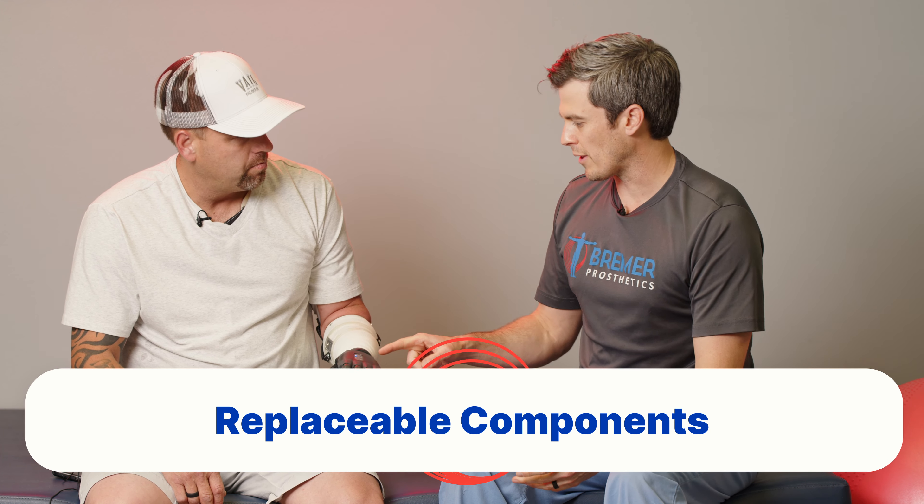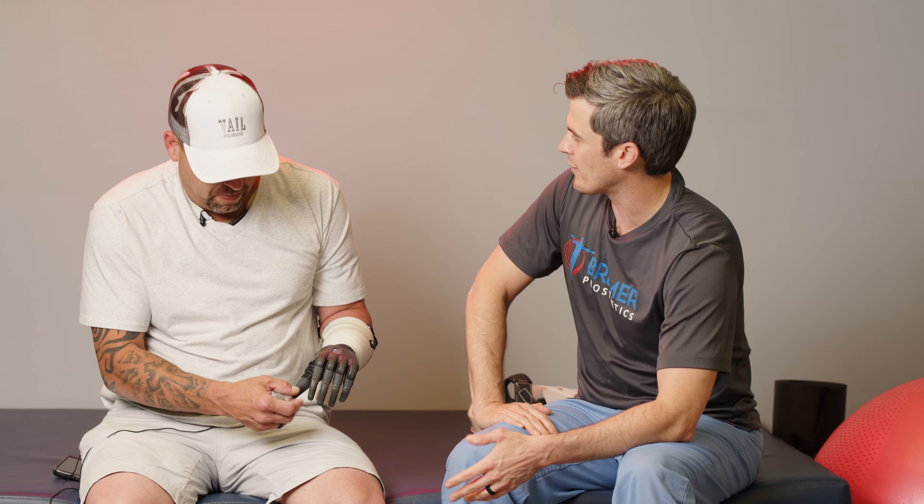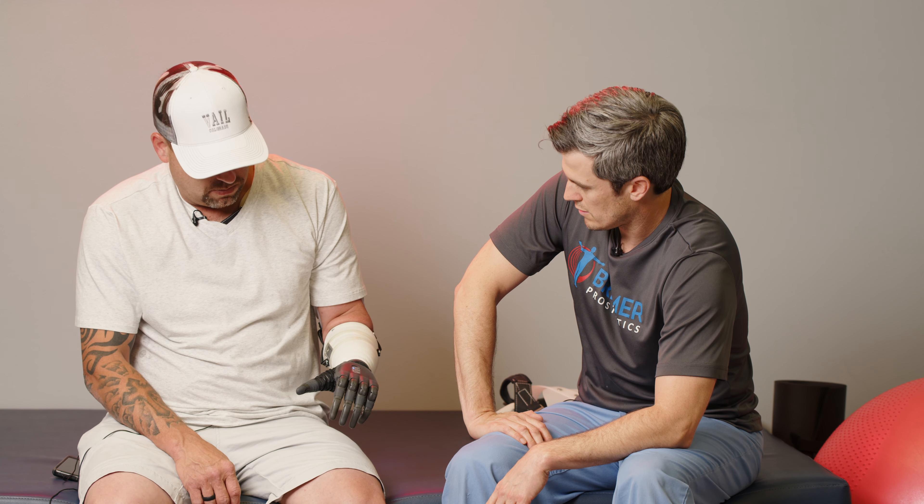All this stuff is replaceable. The webbing here is replaceable. Every finger — everything is replaceable. If you break anything, that's all covered.